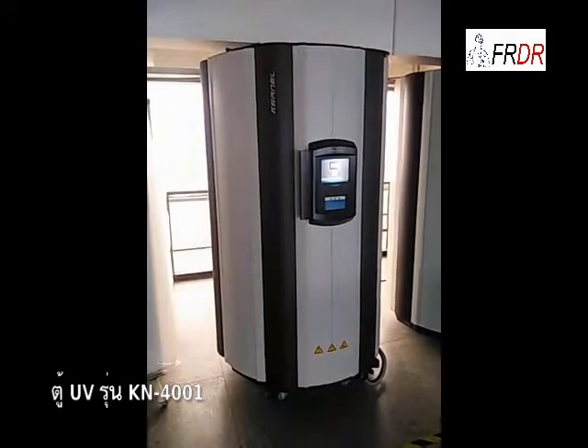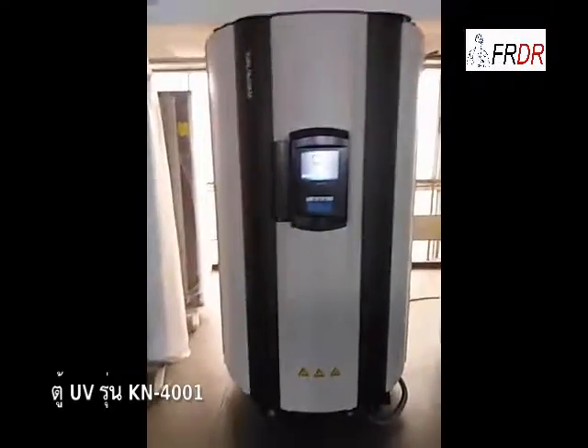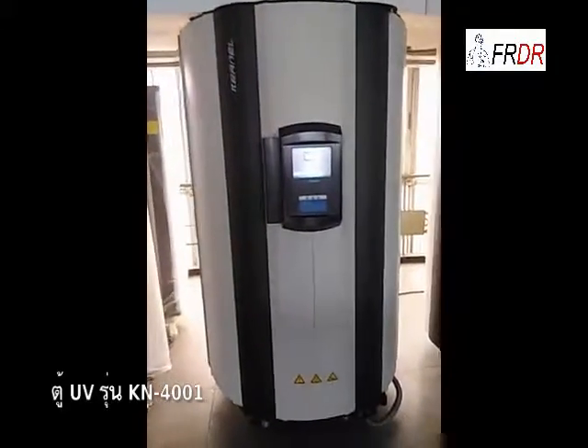Hello, John. This is our whole body chamber. Model number is KN4001, whole body UV photo surface.